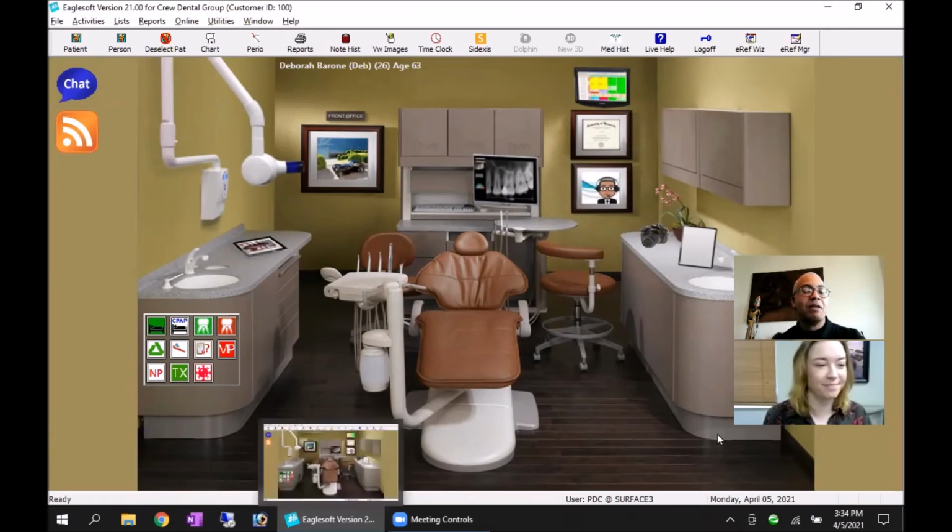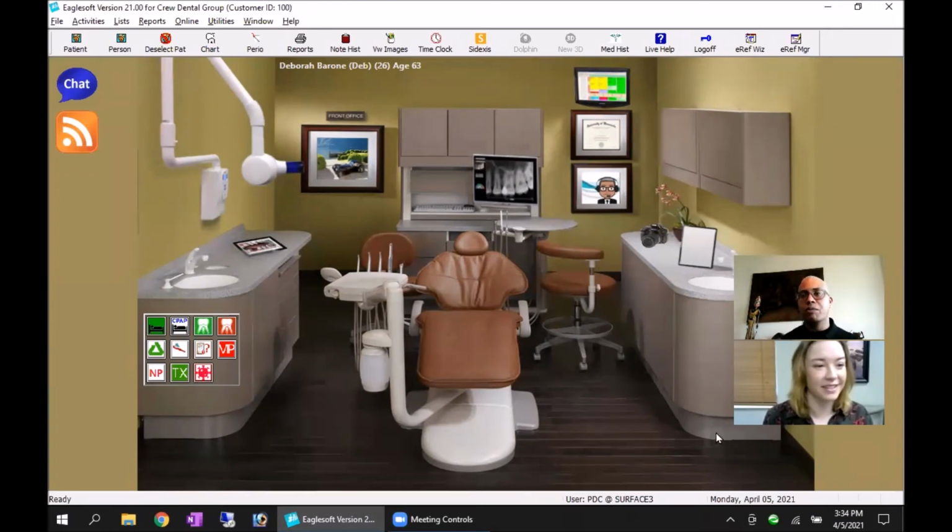But the more you do, the more you realize that they help. And so many offices ignore some of these things, like we're talking about with charting. If you don't see it, you miss it. If you don't see that there's custom abutments to be built out, they get missed. And there's a lot of money there. And that's a big apology you have to make for your patients.